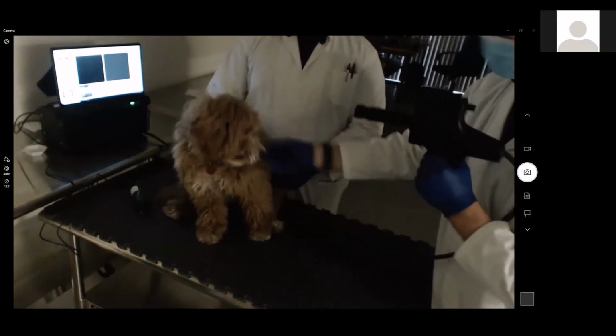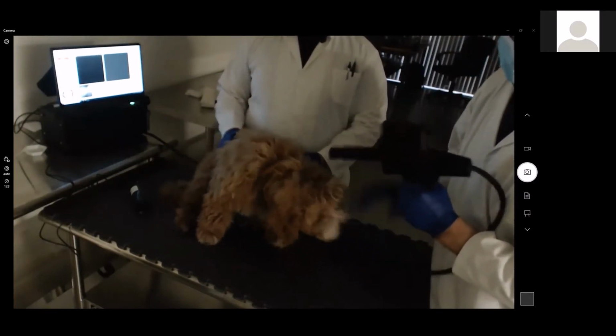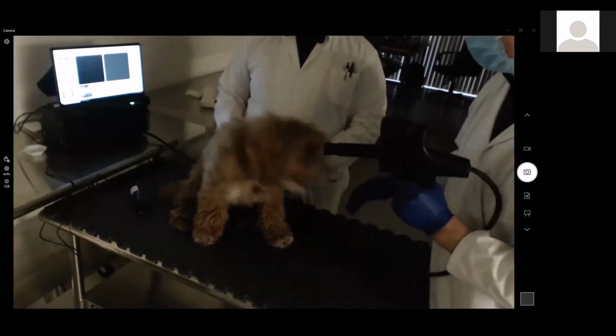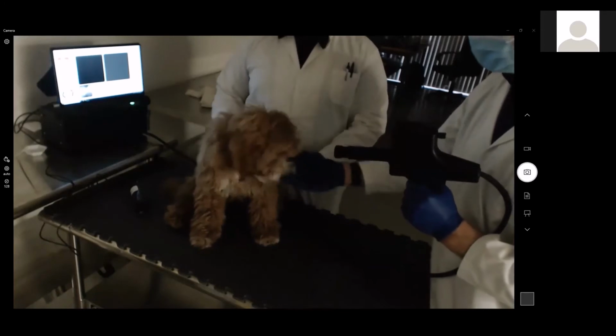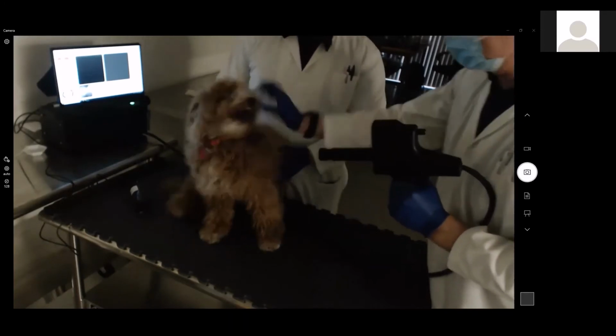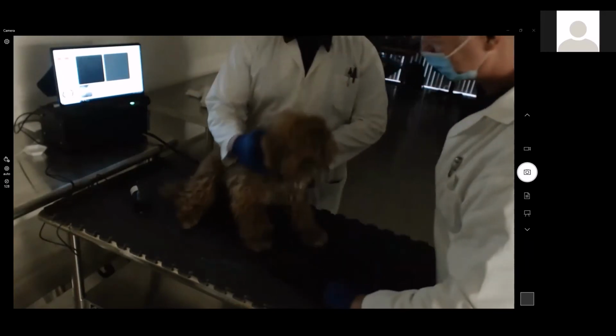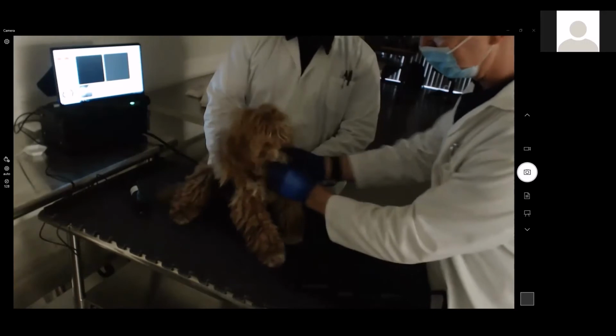So we'll capture some video of me doing this another time if I don't get it, and we'll send that out, okay? But you can see it's a bit of a challenge. Any animal trying to do a wake, every animal's personality is going to come into this in terms of how easy it is to do. Okay, I'll try one more time here.